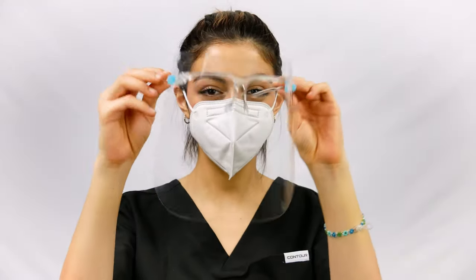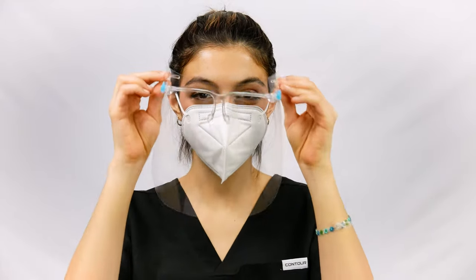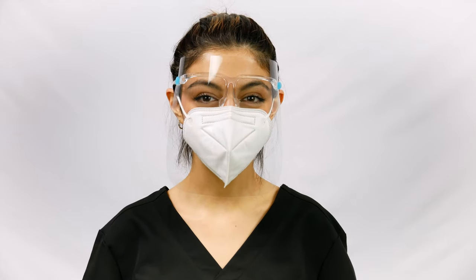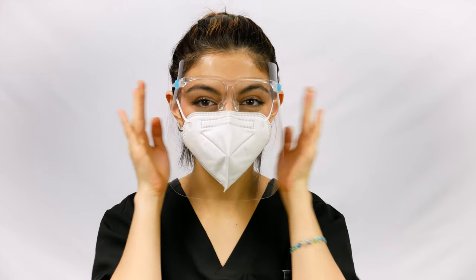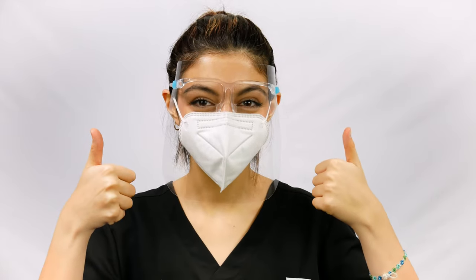When finished, put on the AccuMed face shield as you would a normal pair of glasses. Adjust the shield as needed to a comfortable position. The glasses can fit most eyeglasses for a comfortable and secure fit. And that's all there is to it!